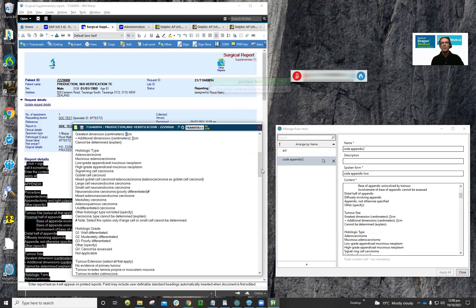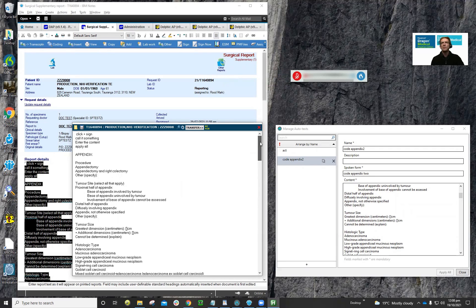That's even better, but we could do even better than this. The limitation with auto text is that you can't have any formatting within the text itself. So I'd recommend users not to use auto text, but to use stored text as a step-by-step command. I'll show you how that works.